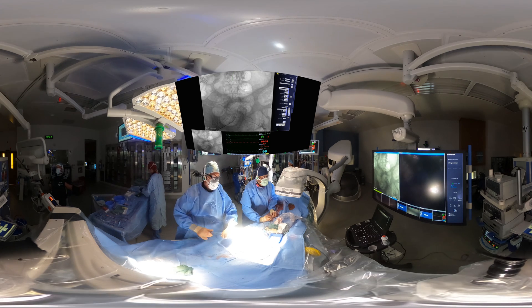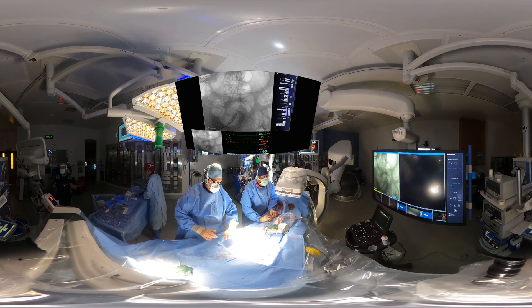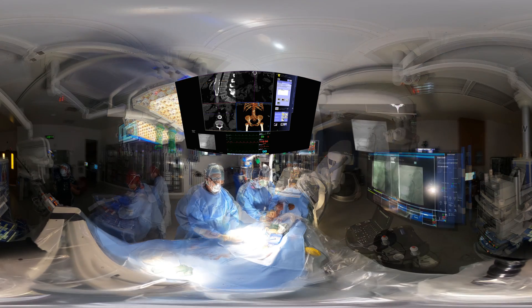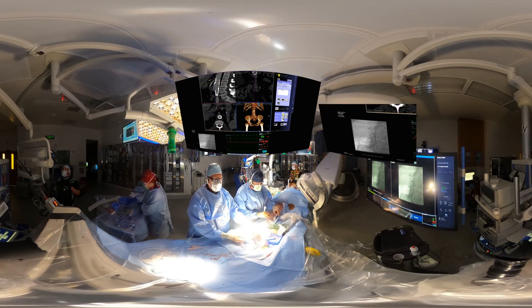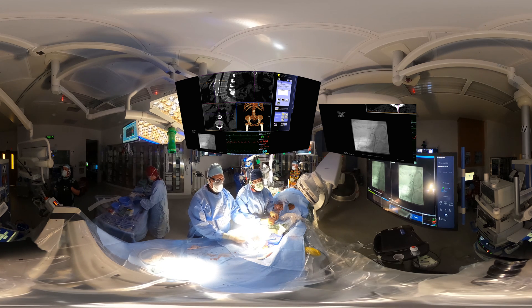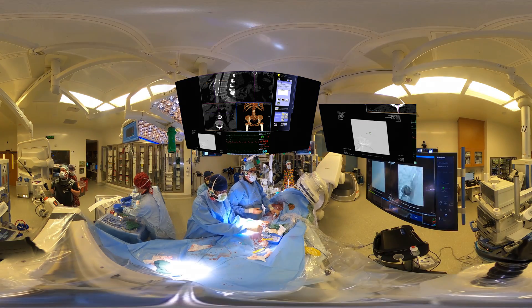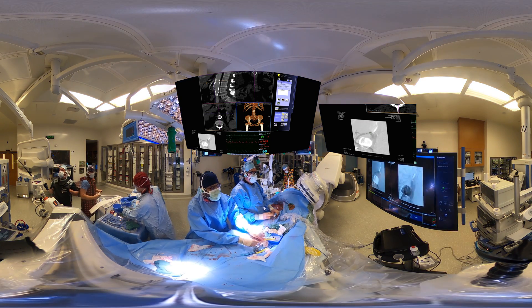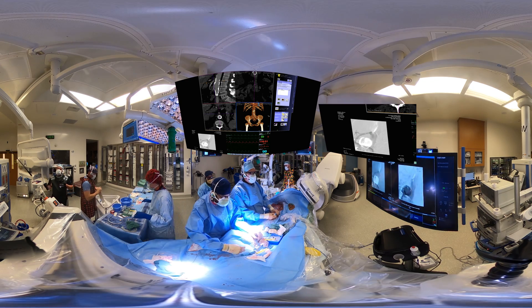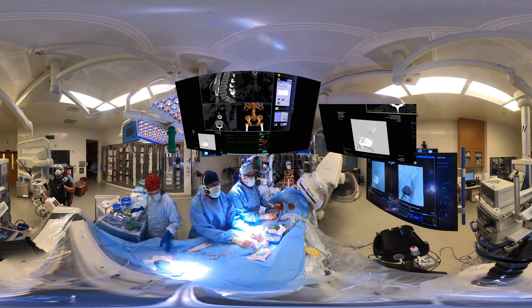One of the nice things about 360 is you can actually drive around this room and see the various different support mechanisms. This is our tech, this is our scrub nurse, and this is the circulator. We can essentially capture all the activities that are going on in this room. This is a hybrid room with a Siemens Phenol.